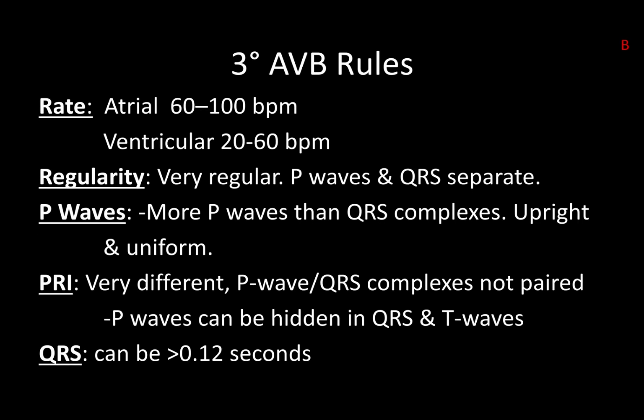What are the rules for third degree AV block or complete heart block? There's a couple different things that we wind up calling it. I'll usually call it third degree most of the time, because there's only one other thing that we really talk about third degrees for, at least without being in a burn unit. Anyhow, what you're going to see is this. The atria are going to be clipping along at a nice normal rate.